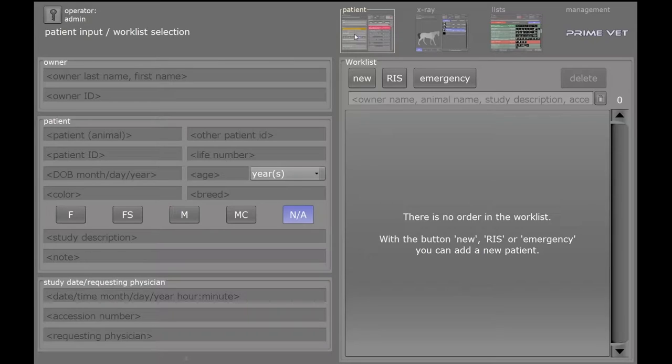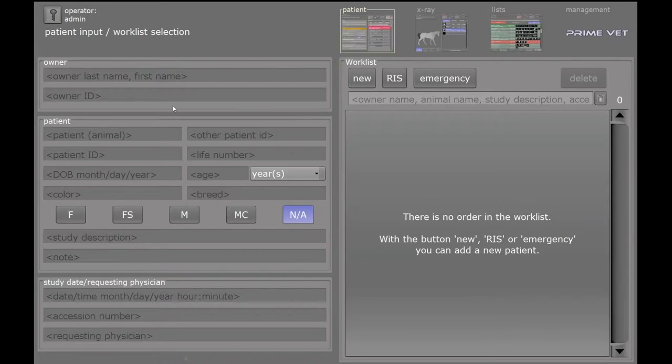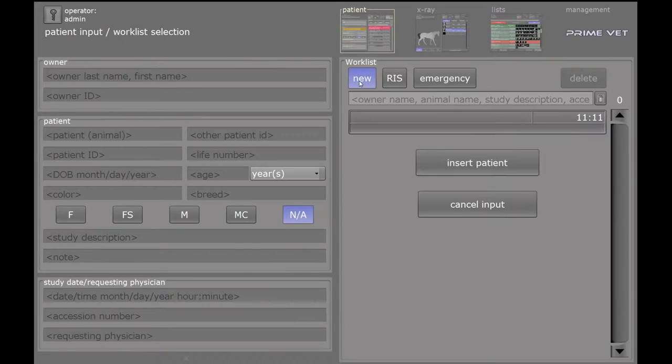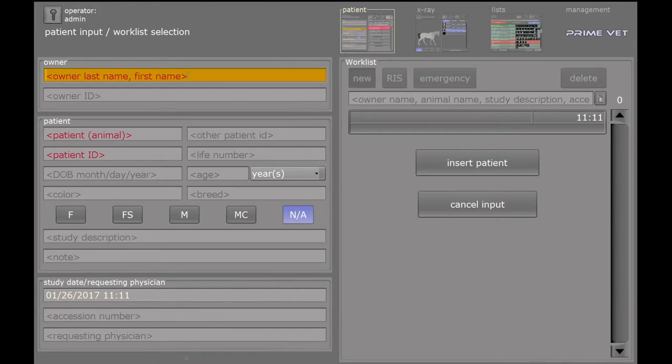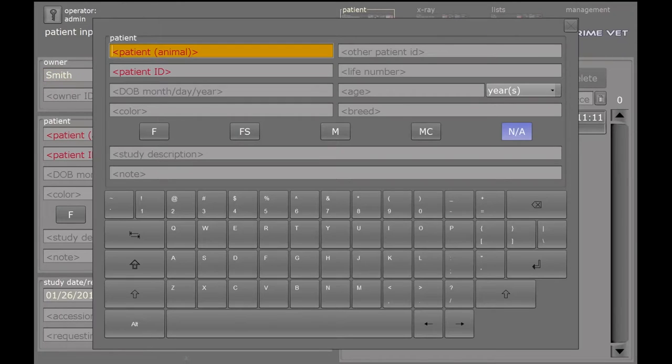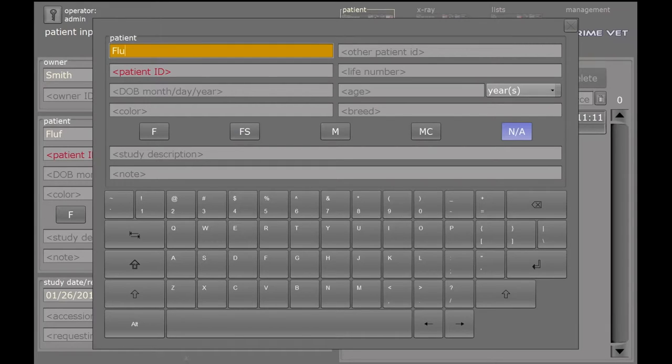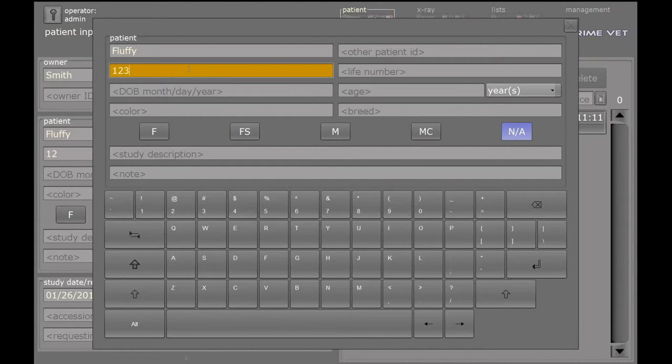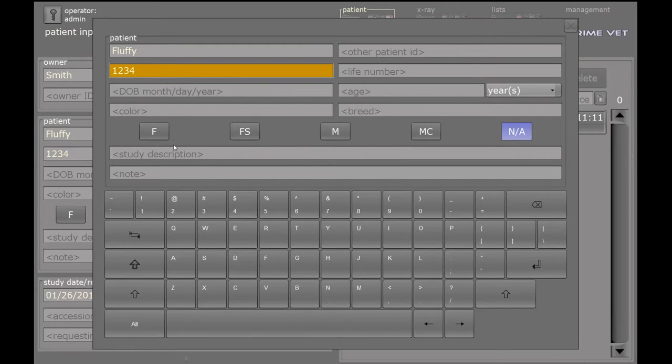So we're going to go ahead and run through, click on Patient, and then right here is all the demographics that we need to key in. So very simply, I'm going to click New, Owner's Last Name, and then Patient, Animal's Name, Patient ID, and you can see there's a lot more fields that you can key in.